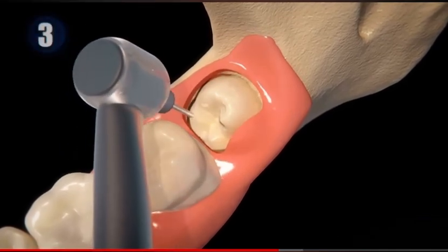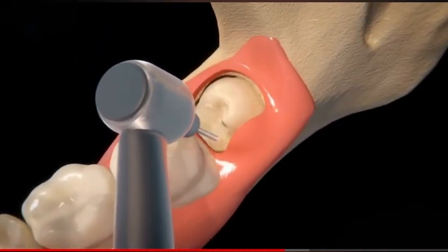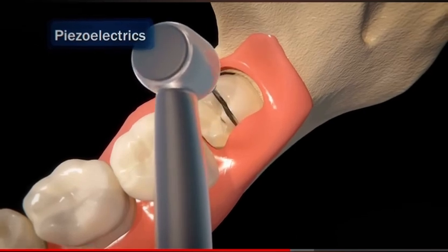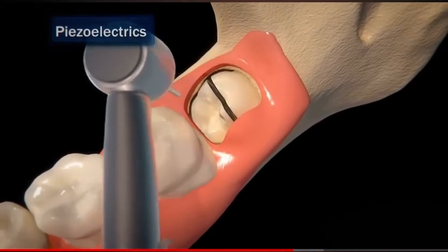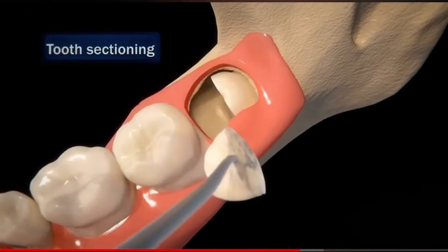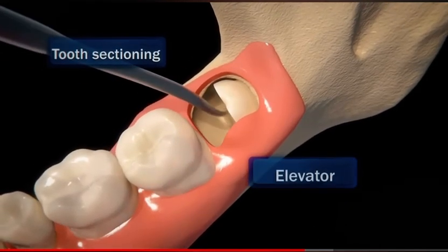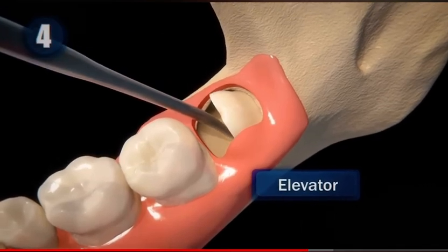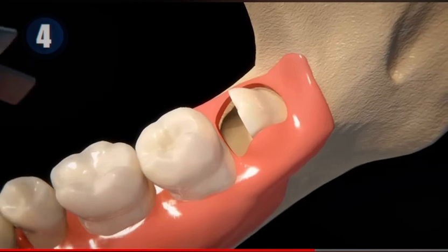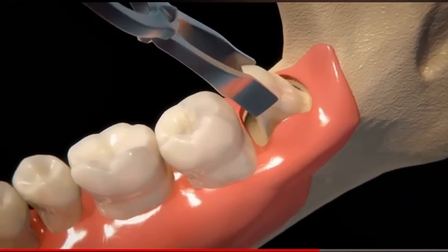Later, contouring will be carried out at the level of the tooth, bone, and then a cut in the wisdom tooth. Once the tooth is divided, the dentist will use an instrument called elevator to push the tooth out. Then with the help of metal tweezers, the expert will proceed to pull it until it is completely out.